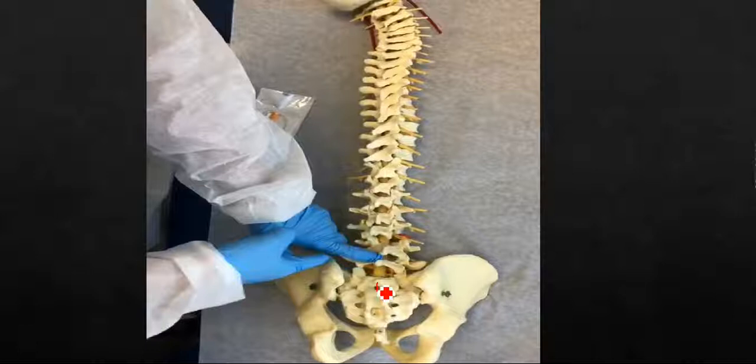First you're going to palpate S1, then you're going to go two finger breadths lateral to that, and then you're going to go two finger breadths superior to that. This point will be the entry point to test for S1. Then superior to that will be L5, superior to that will be L4. So this is basically how you start.